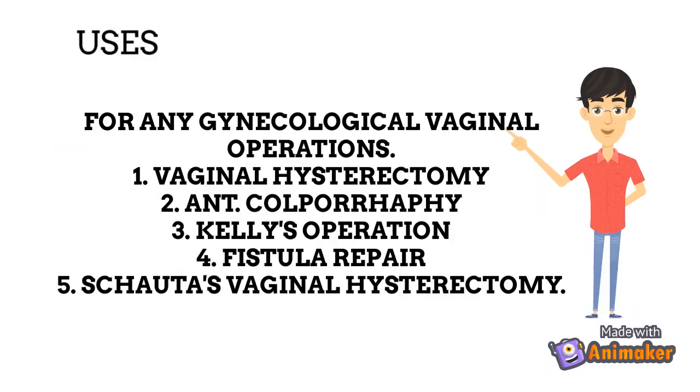What are the uses of this speculum? It is used for any gynecological vaginal operations, such as vaginal hysterectomy, anterior colporrhaphy, vesicovaginal fistula repair, Kelly's operation for urinary stress incontinence, and Schauta's radical vaginal hysterectomy. These are the names of some operations in which the Auvard speculum is used.